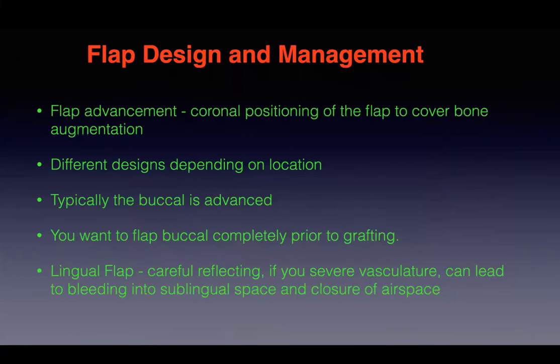For flap designs, you typically want to do coronal positioning of the flap to cover the bone augmentation. There are different designs depending on location. You typically want to advance the buccal flap, and you want to flap that before you start to do grafting. On the lingual flap, you've got to be careful reflecting, especially in the mandibular area, because of the vasculature. It can lead to bleeding and other more serious issues. It's also challenging to do this lingual flap on the maxilla because of that thick palatal tissue.